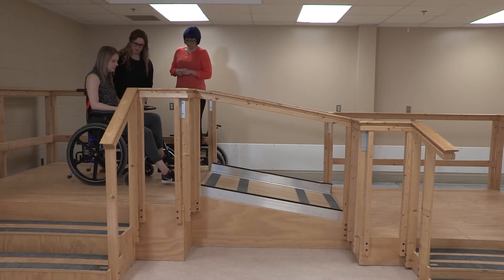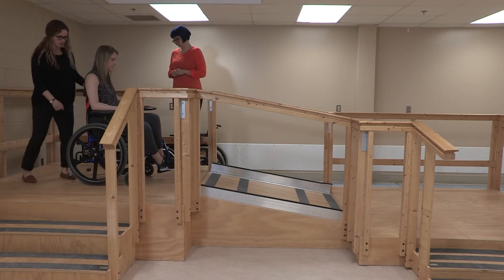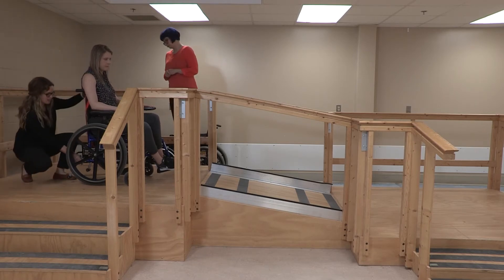Get you to put your foot up there, please. I'll flip the anti-tippers up.